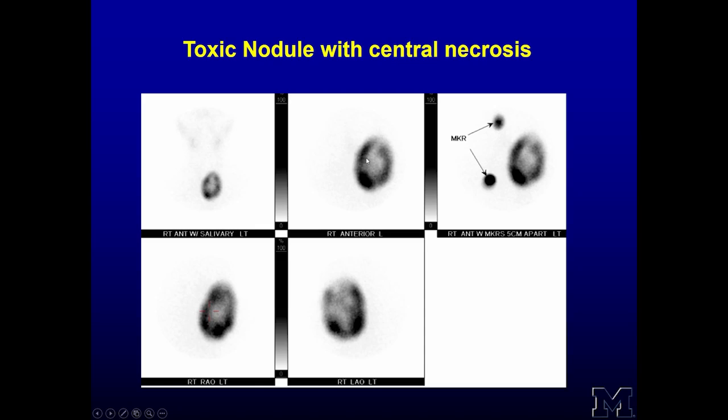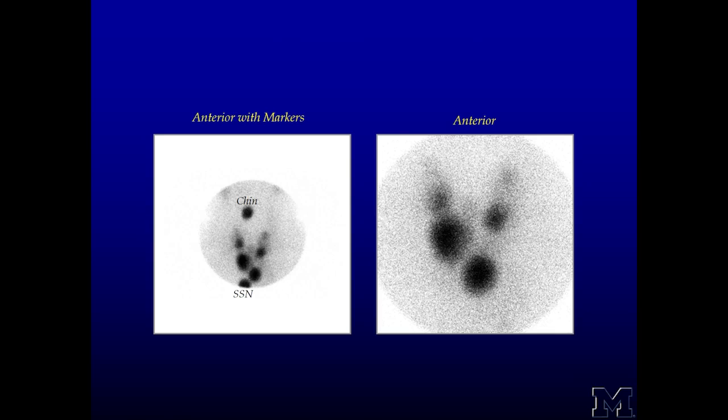So practically the nodule is peripheral hyperactive with a central core of degeneration. The image is typical of thyrotoxicosis due to suppression of the contralateral lobe and very low salivary radiotracer uptake, so consistent with increased thyroid to salivary gland ratio.